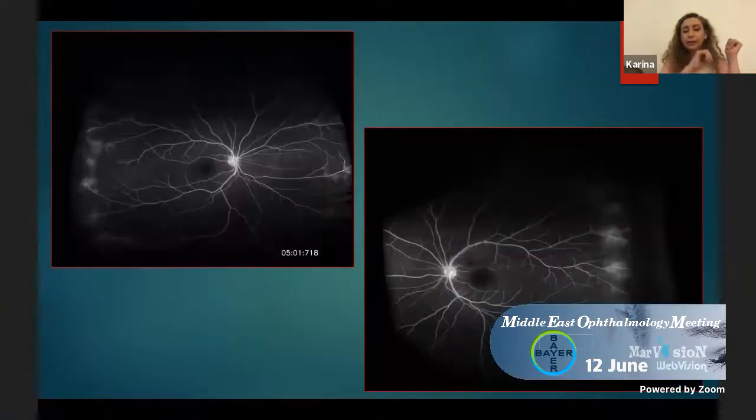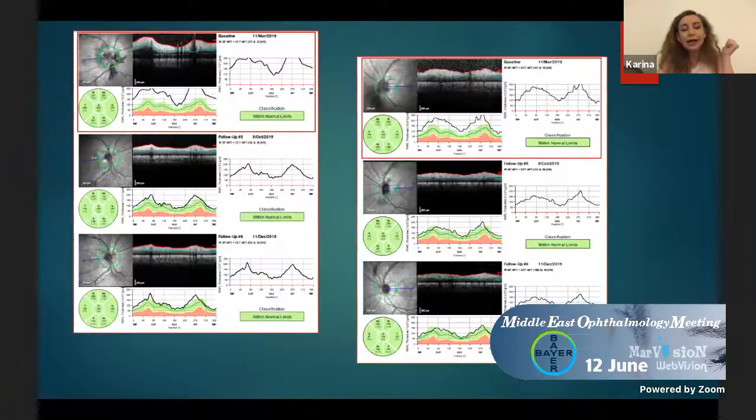After 3 months of the proper treatment, this is how the fluorescein angiography looks like. So see only peripheral areas of small vessels vasculitis in both eyes, no signs of neovascularization. So even though we have a very ischemic peripheral retina, under proper management of inflammation, there's no stimulus for retinal neovascularization. See how nice are the optic discs now, are completely normal.